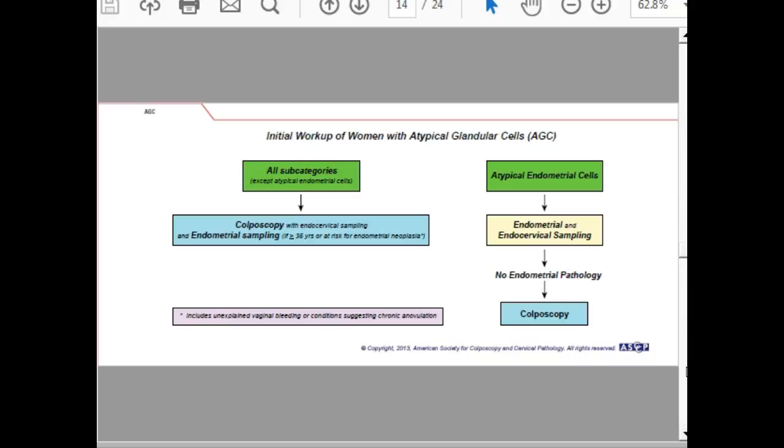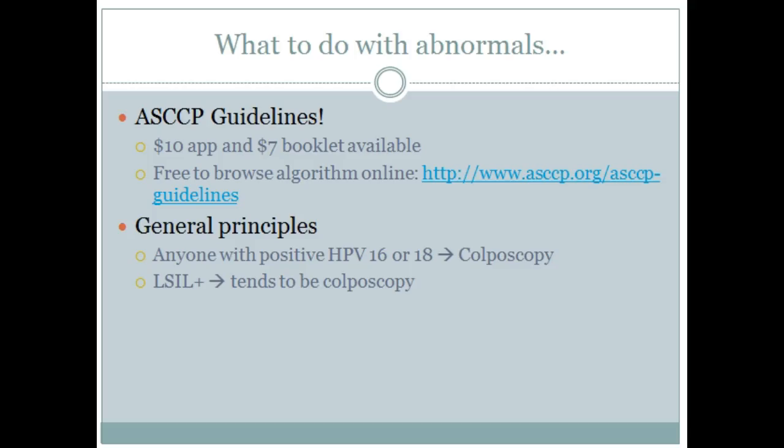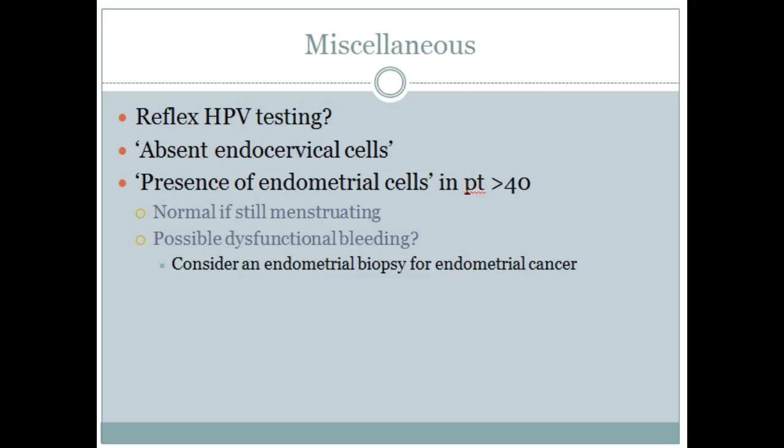All right, so I'm going to leave it at that and let you look through that yourself and get comfortable with it, and then your quiz this week will be on being able to maneuver it. Okay. Next slide. Miscellaneous. Okay, so we've pretty much already talked about reflex HPV testing. We're just doing it in the event of ASCUS. But then you can also reflex for what type of HPV too.